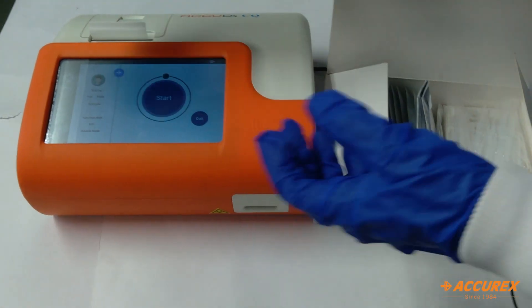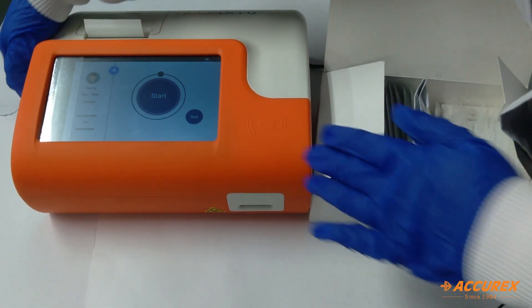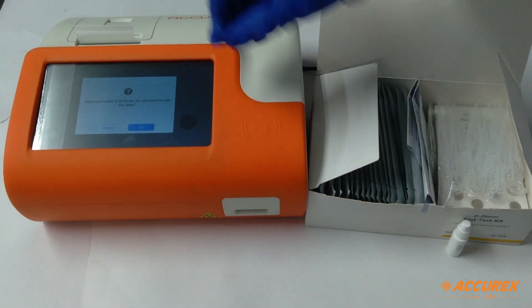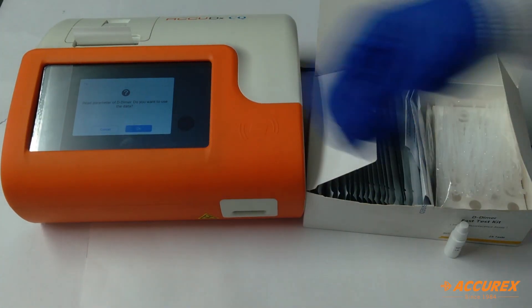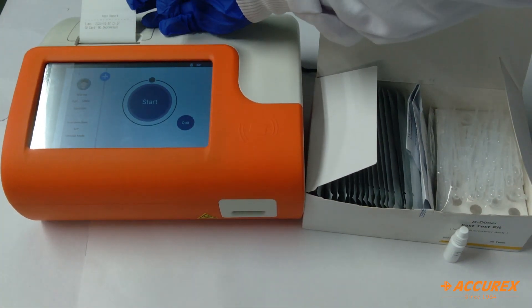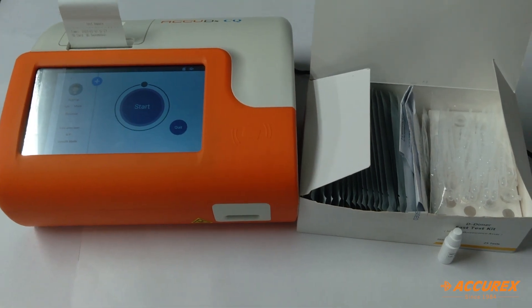As you insert the SD card, you will get a notification. You will click on OK. It says SD card QC successful, so now you can start with the testing.